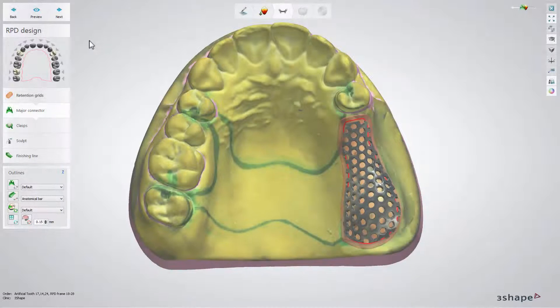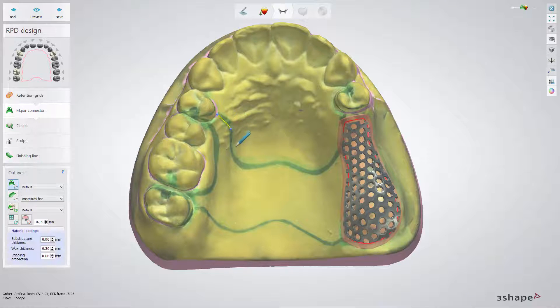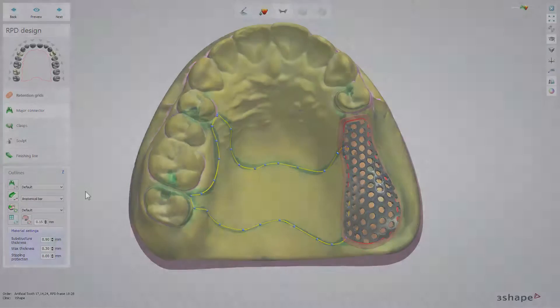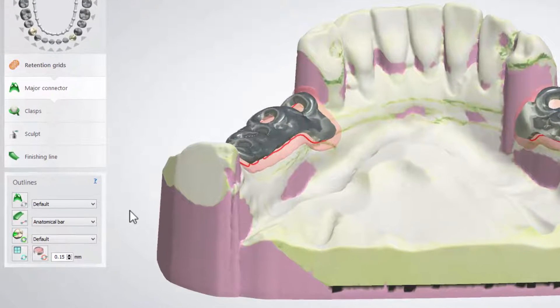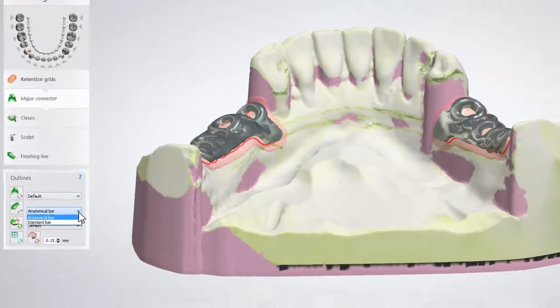The Major Connector step is for connecting the retention grid with the help of different outlines. Use Major Connector for the upper jaw and Lingual Bar for the lower jaw. For the lower jaw, you can choose between an anatomical and a standard bar.